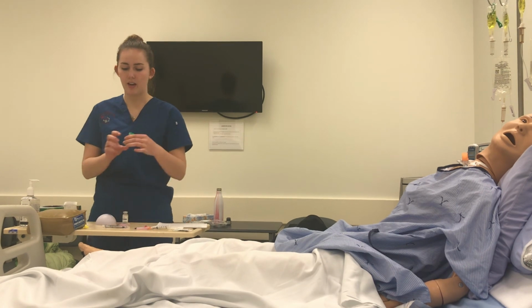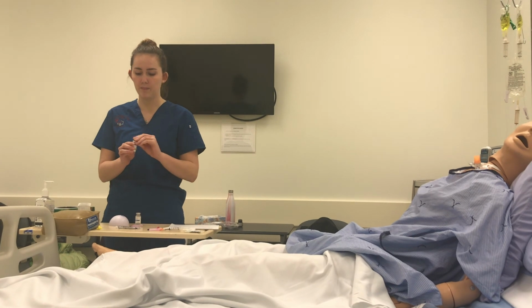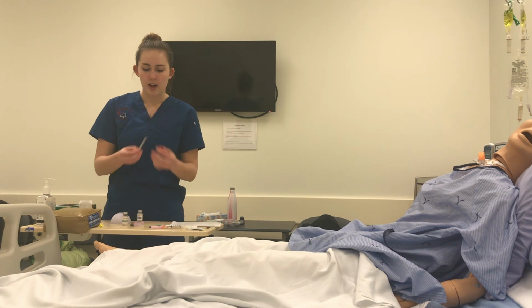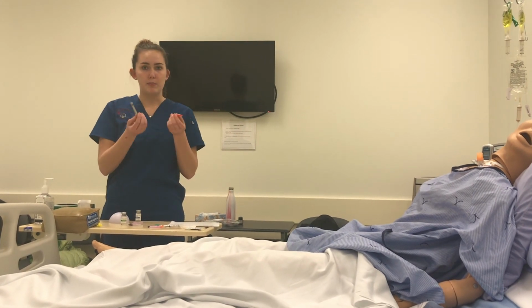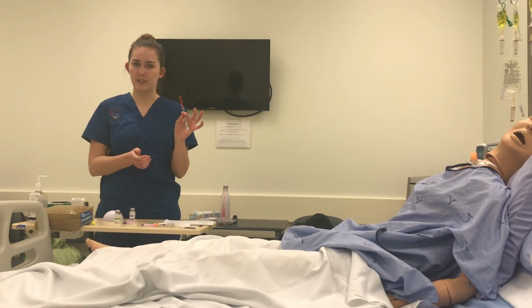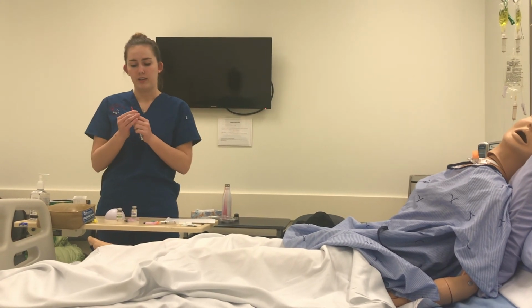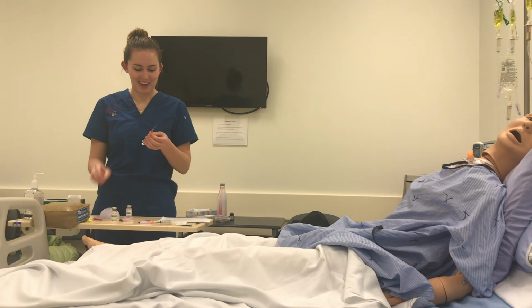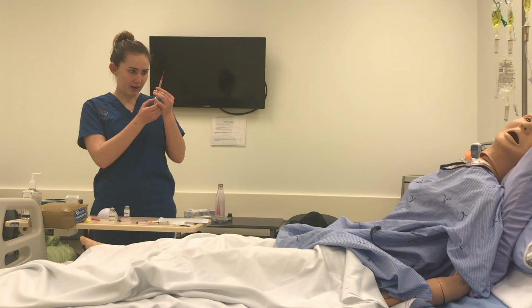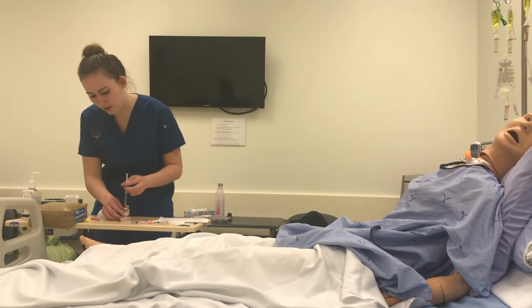Now we're going to administer the 0.5 milliliters of Haldol with a 22 gauge needle, taking off the lid the same way we did with the other. I'm using a 1 milliliter syringe just because we need 0.5 of a milliliter. And for the purposes of this assessment, I'm using the same blunt needle, but I would use a different needle for this case. Okay, so now I'm going to draw out 0.5 milliliters of air, insert this into the vial, and pressurize the capsule.